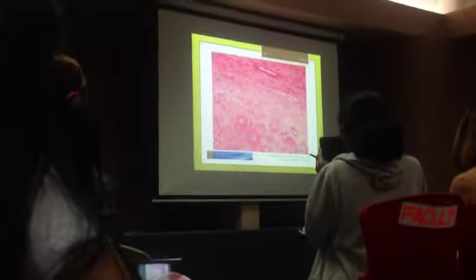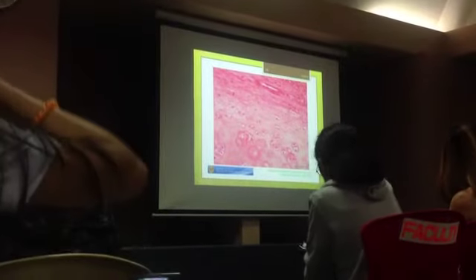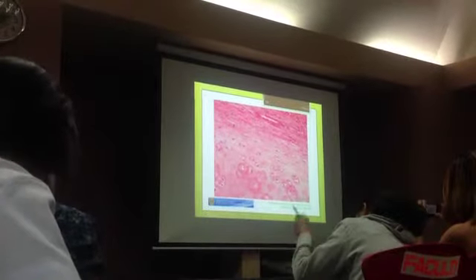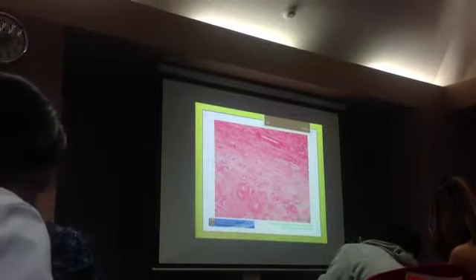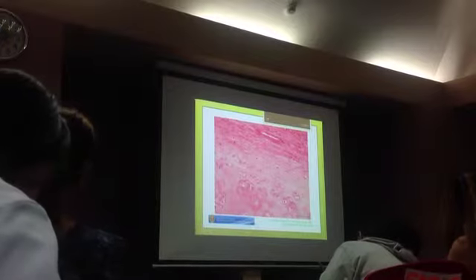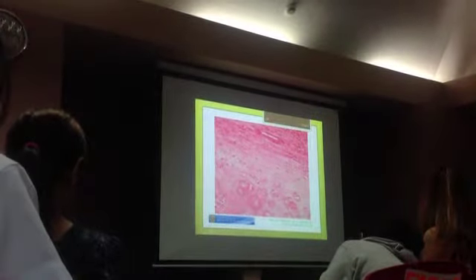Identify pointed layer. Your perichondrium. The covering of your cartilage is called your perichondrium. So which type of cartilage doesn't have any perichondrium?